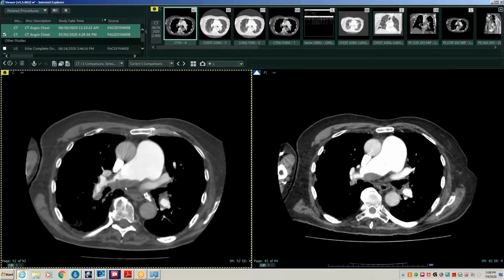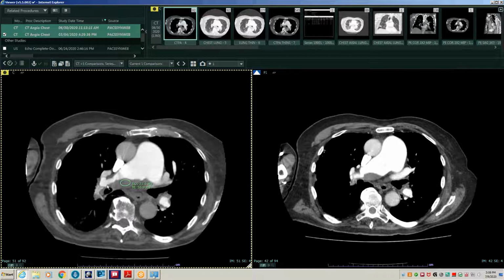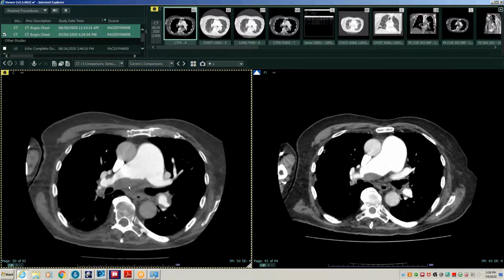But my main question is really, what do we make of it? Are we convinced that this is a chronic pulmonary embolism? Or is this possibly one of these mural hematomas as a complication of severe pulmonary hypertension? No, it's CTEPH. I mean, it layers up like that. It progresses if the patient's not put on anticoagulation.